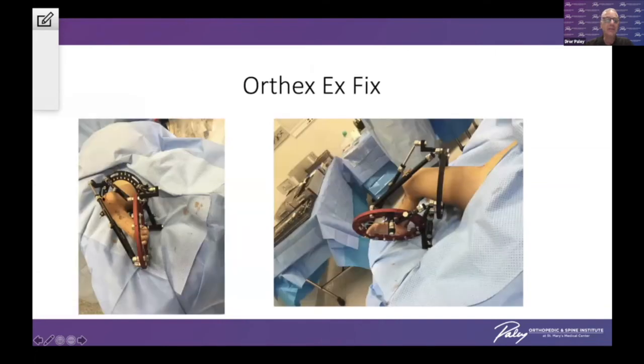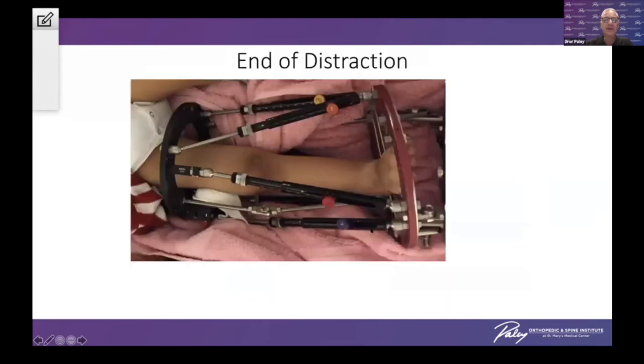Here's an example on a tibial hemimelia child. You can see with the Z-plates in the back and the Z-plates in the front, a severe greater-than-90-degree correction at the knee and a large correction at the foot. This is shown at the end of the distraction.